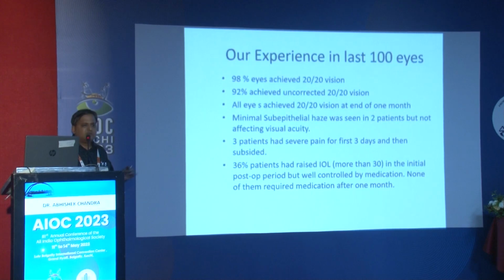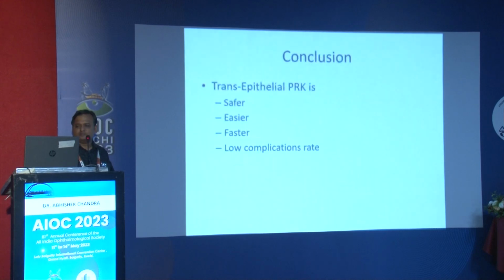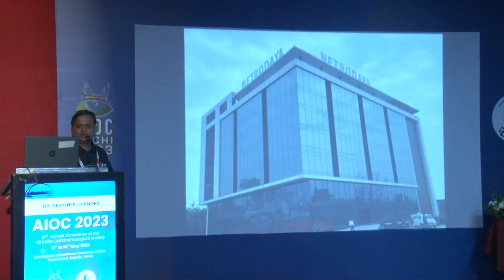But with medications, everybody was controlled, and after 1 month, we had to discontinue the anti-glaucoma medication. So to conclude, transepithelial PRK is safer, easier, faster, with low complication rate.